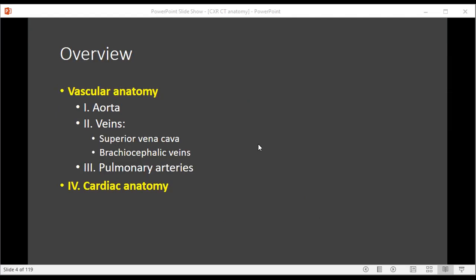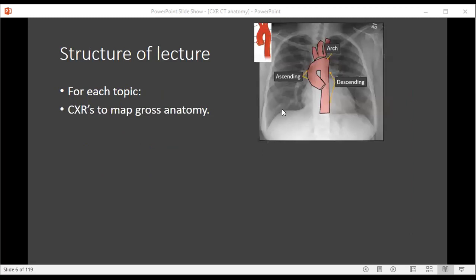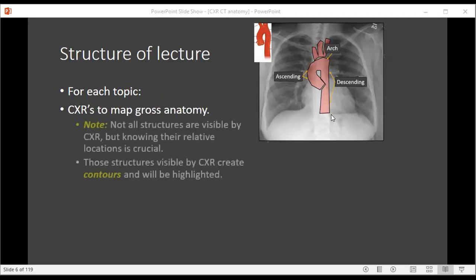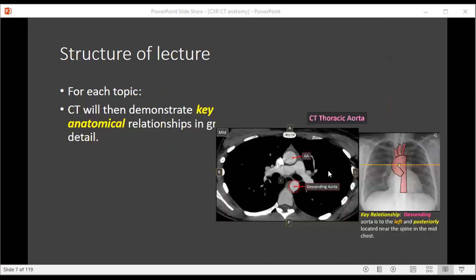We'll be covering both vascular and cardiac anatomy. In the structure of this lecture we will review all the anatomical structures with diagrams, some from the dissector, and in addition we'll also be looking at the gross anatomy on chest X-rays to help us map where these structures are located. Not all of the structures are going to be visible by chest X-ray, but knowing where they're actually located is critical. We'll try to outline all the contours that they create which are visible by chest X-ray. We'll then use CT to demonstrate key anatomical relationships in greater detail, and those key relationships will be outlined at the bottom of each of the CT images.